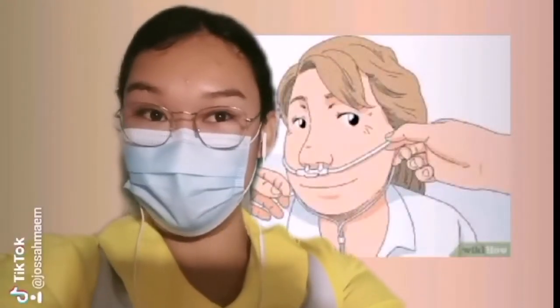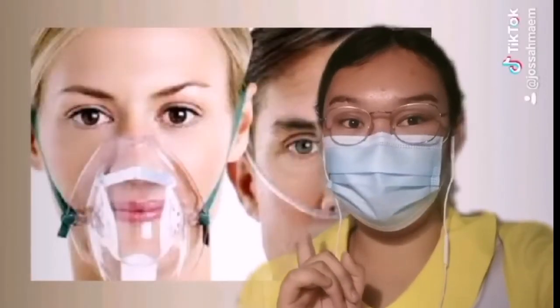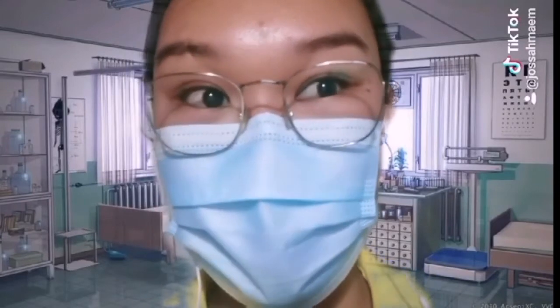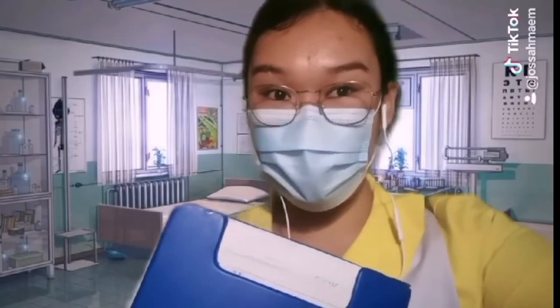Remove the cannula each shift or every 4 hours to assess the skin and to avoid medical device pressure injury. Don't forget to remove the mask every 2 to 4 hours. Wipe away accumulated mist and assess the underlying skin. Don't forget to discard used equipment properly. And then last, document the procedure, the patient's response, and other important data on the client's chart.